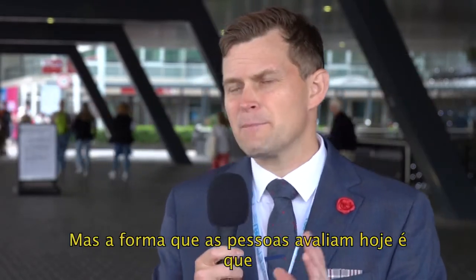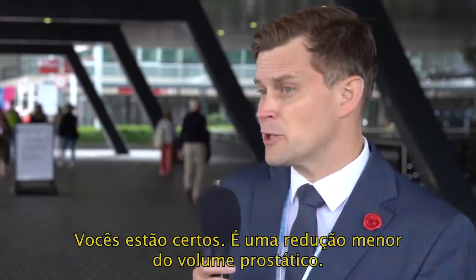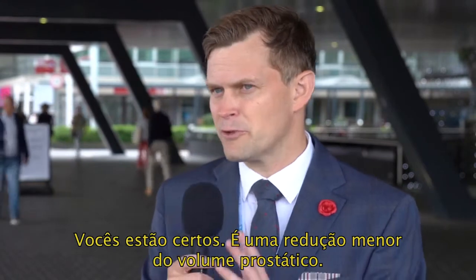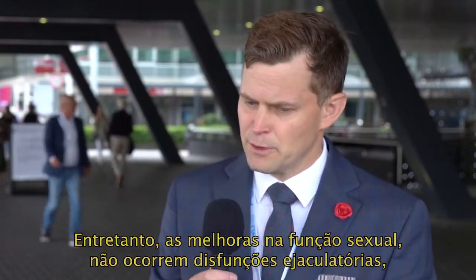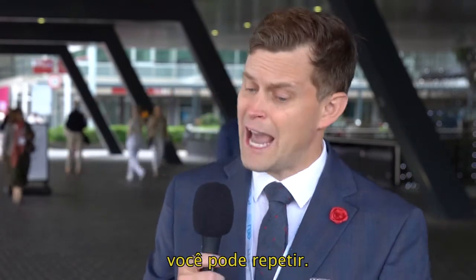But the way I look at it, and some people say, it's not as good as enucleation, or it's not as good as green light. You're right. It's a smaller reduction. Yep. However, the sexual improvement, there's not the ejaculatory dysfunction. There's no ED. You can redo it.